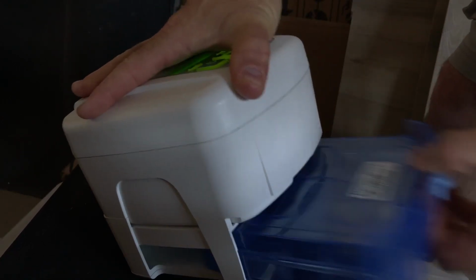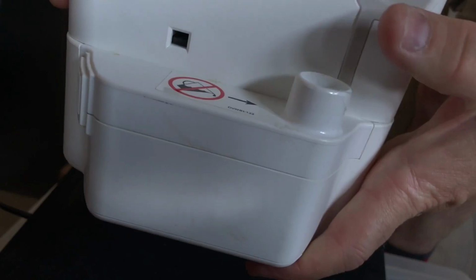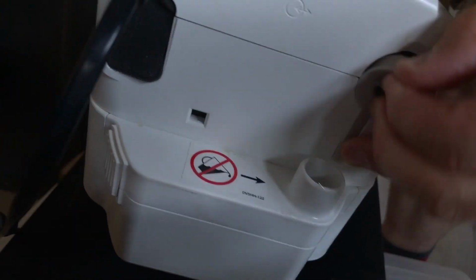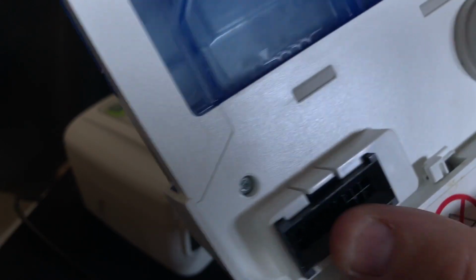So this here is the water reservoir. You can see there. That's for humidifying the air. This bottom part opens. There's some extra components here. I'm not sure what this is. Maybe that's where you attach another hose. I'm not sure. And then here, this opens here. It comes apart like that. And this was what the water reservoir went into over here. You can see there's some electronic components in here and some kind of connector.